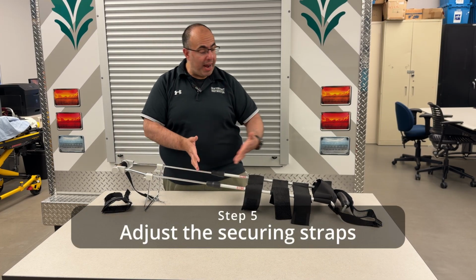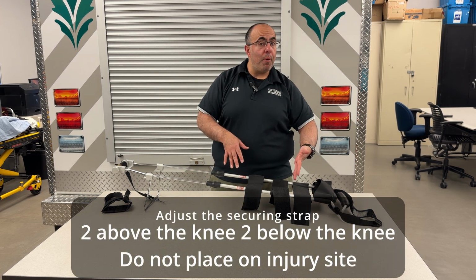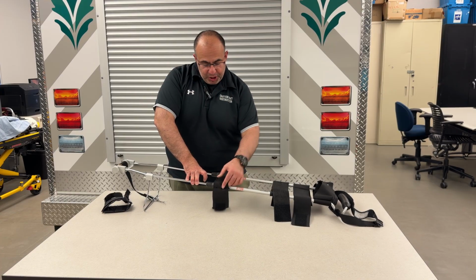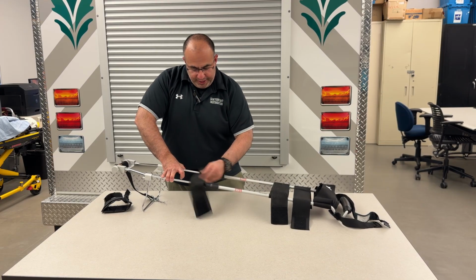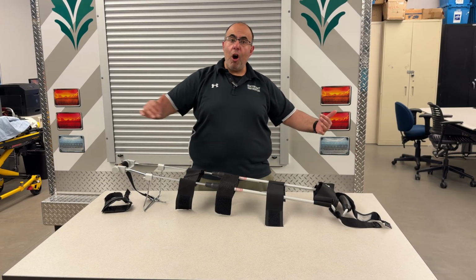On the uninjured side is where you adjust your securing strap. Two above the knee, two below the knee. The two above the knee, make sure that it's not over the actual injured site. As you're adjusting your securing straps, all you need to do is just adjust it over the device, and then you lay it out game ready. So when you're ready to insert this underneath your patient's injured side, you're all golden.